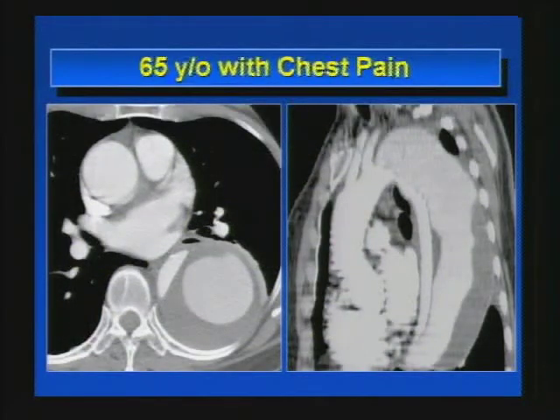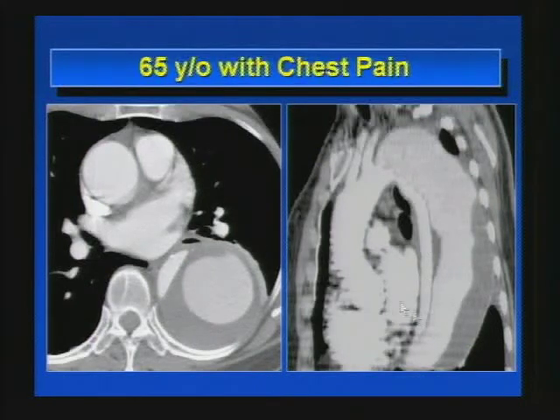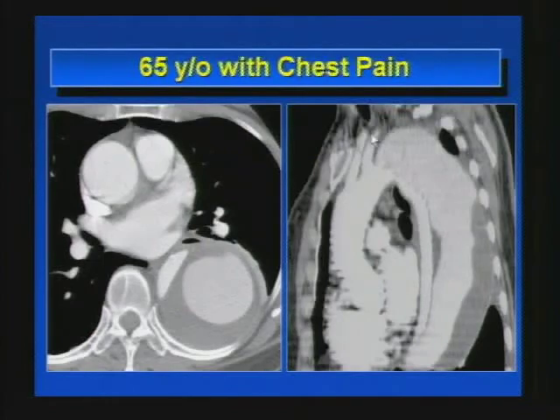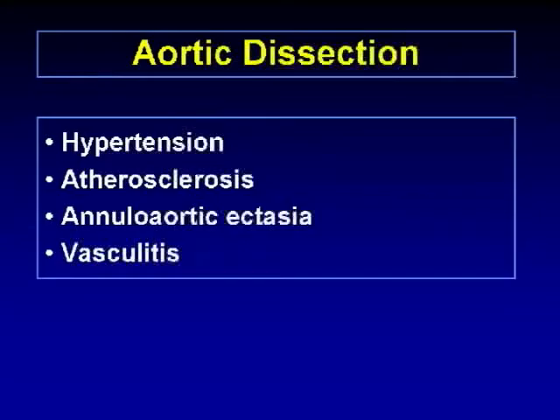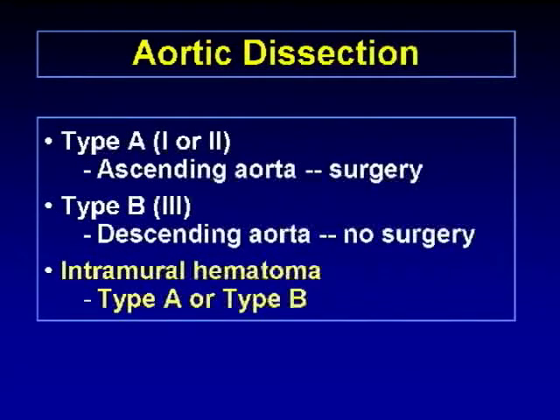Next case: 65-year-old with chest pain showing a dissection of the thoracic aorta. Key points include compression of the true lumen, which is deviated anteriorly and medially, and is significantly compressed by a false lumen that is partially thrombosed. Here we see the left carotid artery and left subclavian artery — the dissection starts immediately distal to the left subclavian, making this a type B dissection. Hypertension, atherosclerosis, annuloaortic ectasia, and vasculitis are associated risk factors. Type A dissection involves the ascending aorta and is managed surgically; type B involves the descending aorta and is managed medically.